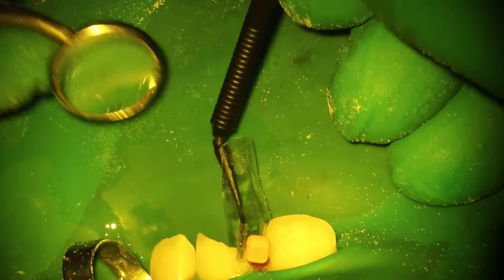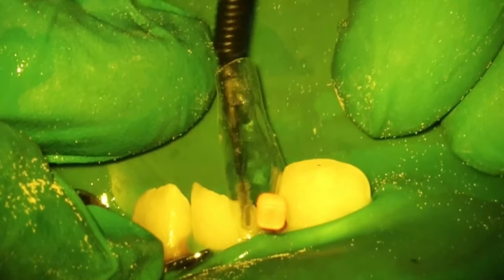The second problem was my mistake. With the clear fill, I should have air thinned and cured it. With the technique as prescribed by Dr. Clark, you generally don't have to light cure the type of bonding agent he had. In this case, though, I think that was the problem. Without air thinning and getting that nice light cured area for the composite to bond onto, I think that killed the bond strength. That would be most likely what happened.